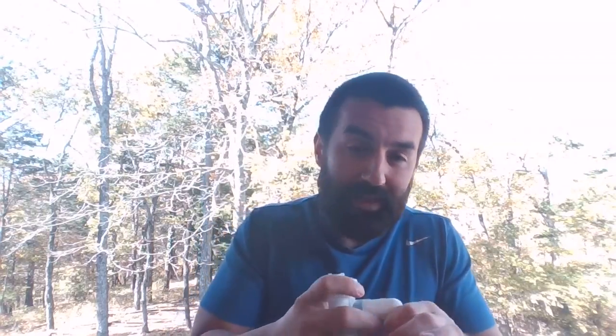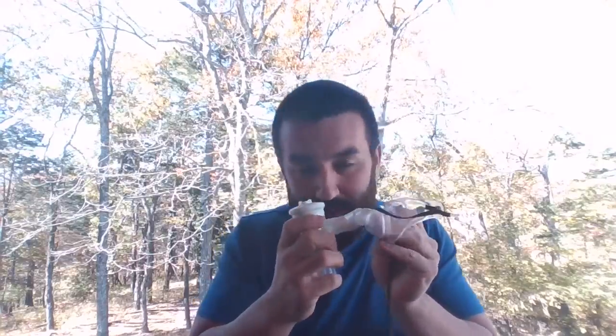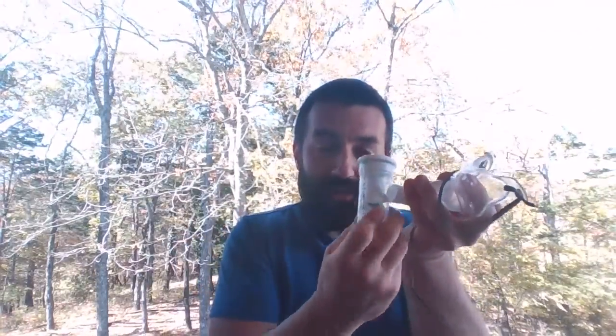So I'll show you what I do, and I'm a weirdo. Okay, I like all the different little respiratory fittings and things like that. I might do it at first if all I have is this. I can make this work and try to position you and really articulate and manipulate, and get this thing to sit as upright as I can. But when I get a chance, I'll go back down to the department and I'll grab one of these.